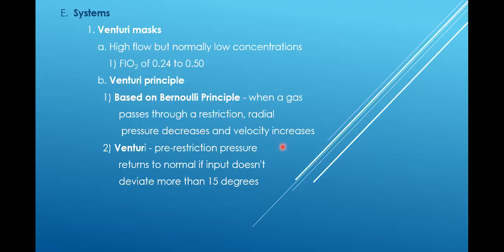All right, so this is a concept you must understand. It's called the magic box. This is going to determine how much oxygen I am giving my patient, how much oxygen and how much flow. The total flow of my device. Trying to find the total flow, a couple of steps are involved, but once you got it, you got it. You can't take those other things for granted. You have to go back and practice those: minute ventilation, tidal volume, dead space. You've got to know how to find that, because when you get a problem that gives you some parameters, you have to know how to go back and find what you need to apply to this problem. Okay, it's not going to give you all of that.